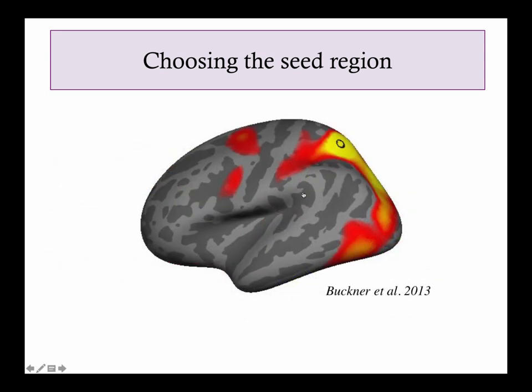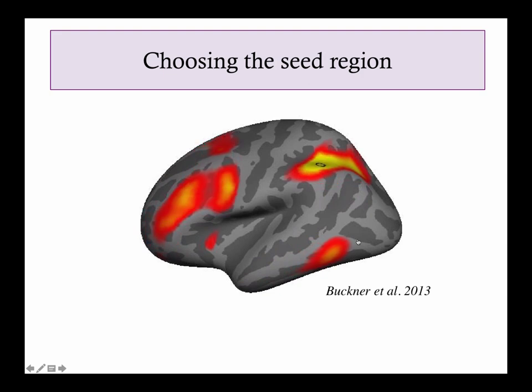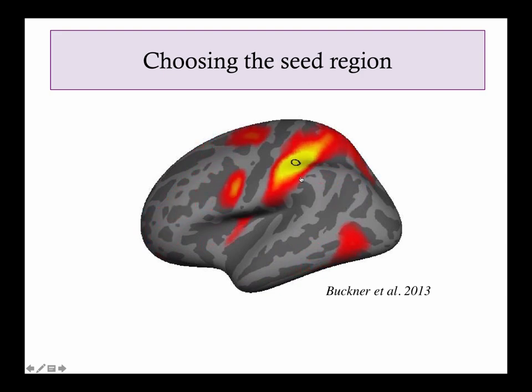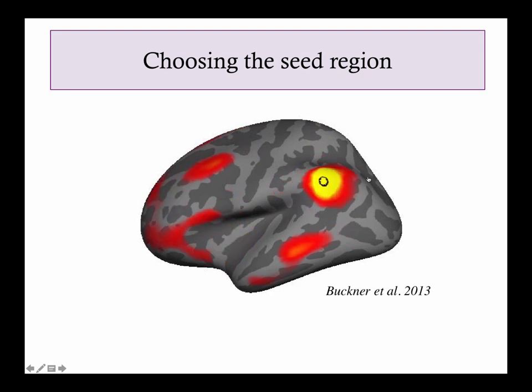And this is a cool illustration of what happens to the seed-based correlation map as you move a seed around different areas of the cortex. So this dot is the seed region, and this was the thresholded correlations with the rest of the brain. And so you can see these kinds of continuous changes in the correlation maps that happen. And so this kind of mapping can help us perhaps learn new things about long-range correlation patterns.